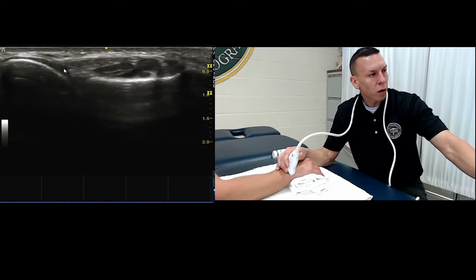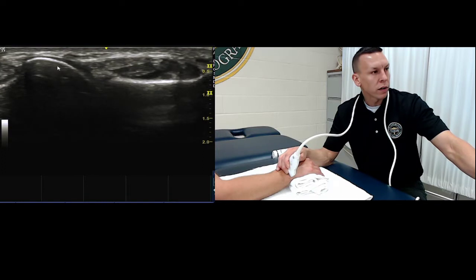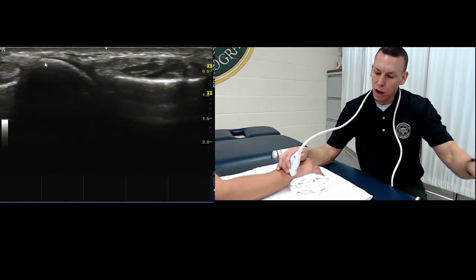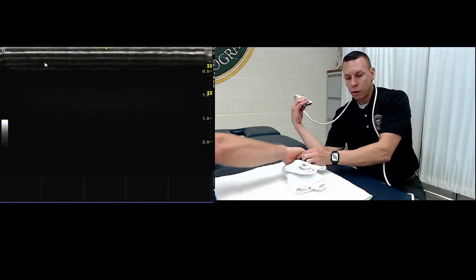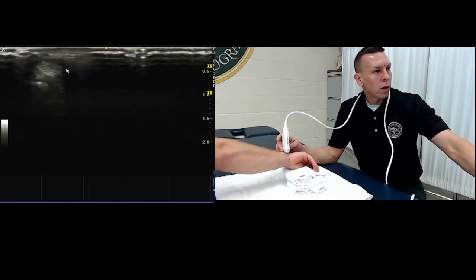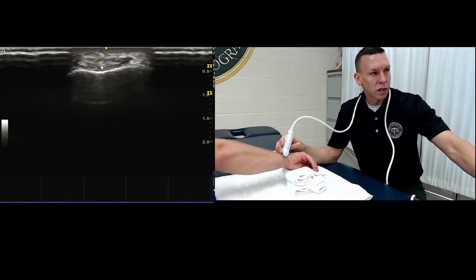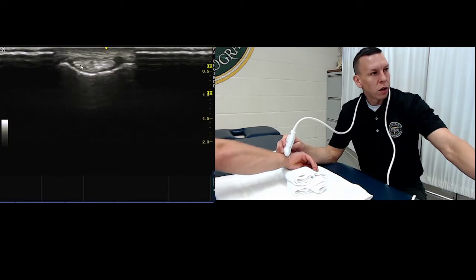And then the last compartment is the sixth compartment, which is the extensor carpi ulnaris. So here we're at the ulna, which is right here, and we're going to slide our probe. Sometimes you need to move their wrist all the way so the pinky's kind of up, and as you come over top of the ulna, the extensor carpi ulnaris sits in this groove. You can see where his thumb's almost straight down, and so that's the extensor carpi ulnaris, and it sits in this groove in the ulna right here.